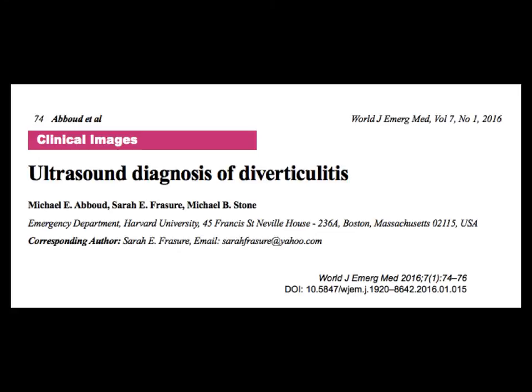So we actually published a case series a couple of years ago now in the World Journal of Emergency Medicine looking at ultrasound diagnosis of diverticulitis. And we looked at multiple patients where we made the diagnosis using point of care ultrasound and then followed up to see how patients were doing. Of the patients that we looked at, 2 of them did very well.